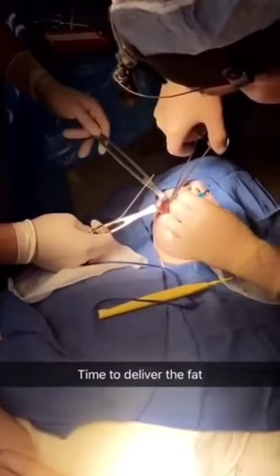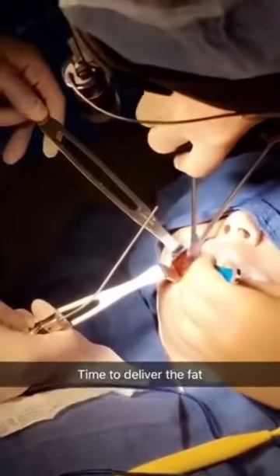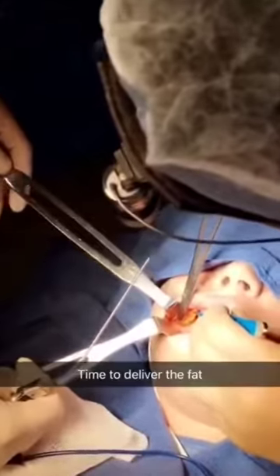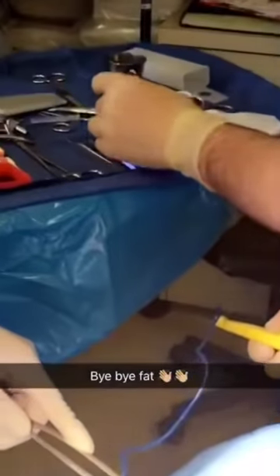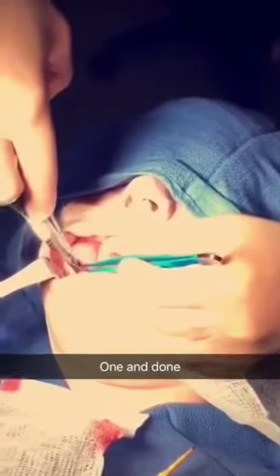I'm going to deliver the fat. The incision that's left — I'm just going to close it with one little suture.